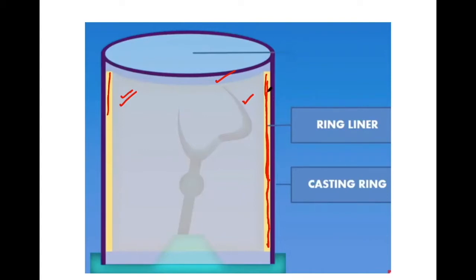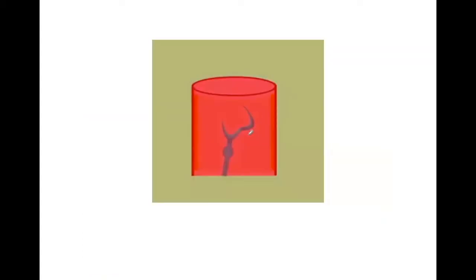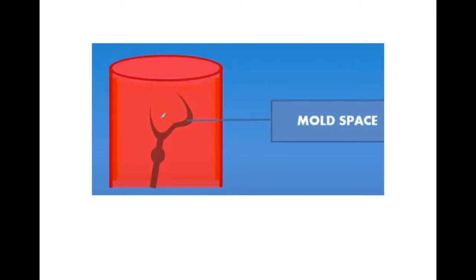Once the investment has set for one hour, it is ready for burnout. We place this investment in the oven. The wax will be removed from the investment material, leaving a resultant hollow mold. For proper elimination of the wax, this mold is placed in the furnace with the sprue hole facing downwards. Because of gravity, the wax will be eliminated from the mold space and once all wax gets melted and lost, this is the hollow mold space which is ready to receive the molten metal.